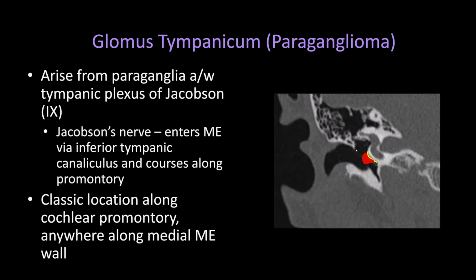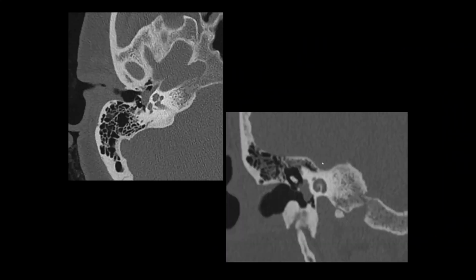And you can see its relationship with the tympanic membrane laterally, which is why you're seeing that red pulsatile mass just behind the membrane. So on imaging, here we can see axial and coronal CT images of the right temporal bone, and we're just going to see non-specific soft tissue in the middle ear cavity. This again is the cochlear promontory over the cochlea, so you can see it right up along the cochlear promontory and laterally abutting the tympanic membrane.